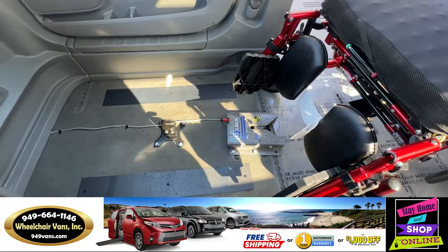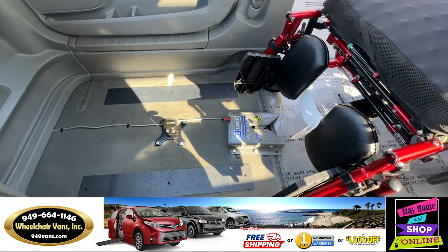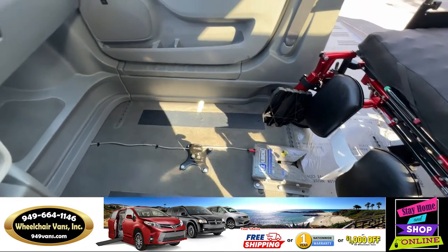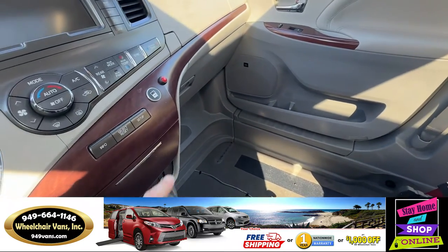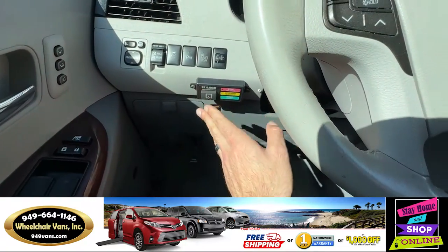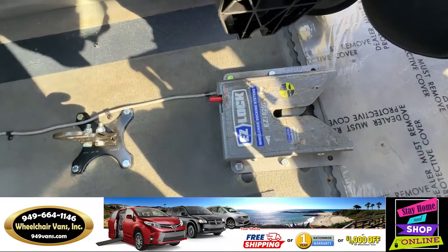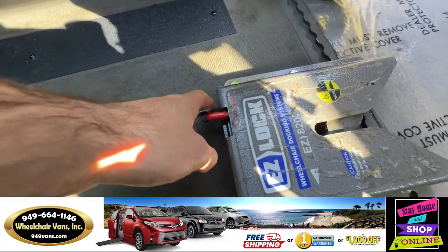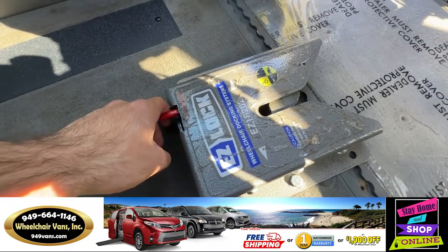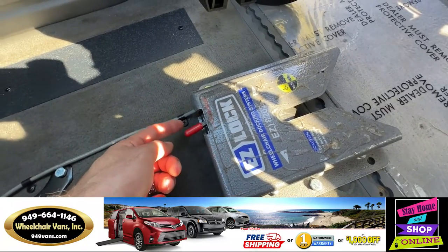Last but not least, I will be going over the emergency manual system. This system is designed for in case of electronic failure — for example, if you hit the button and it doesn't work and your main button doesn't work. You will have a manual lever which you can pull towards you and it will release the chair, so you'll be able to release the chair manually.